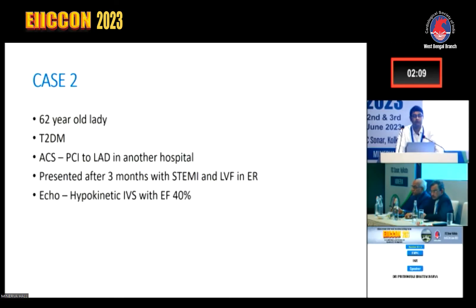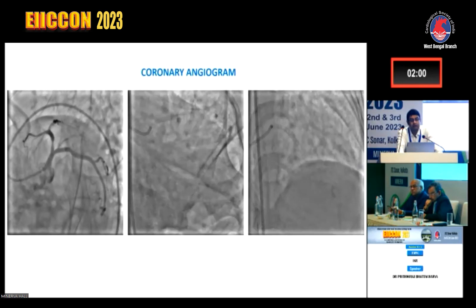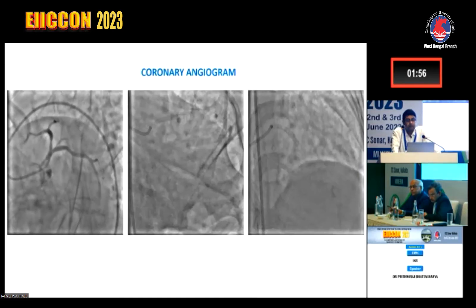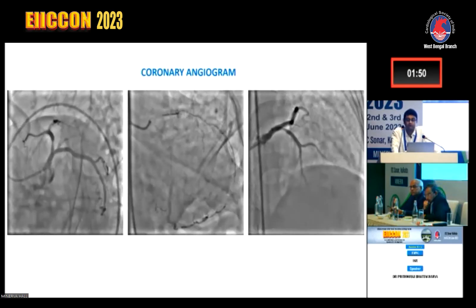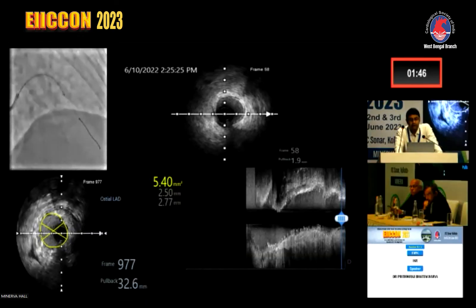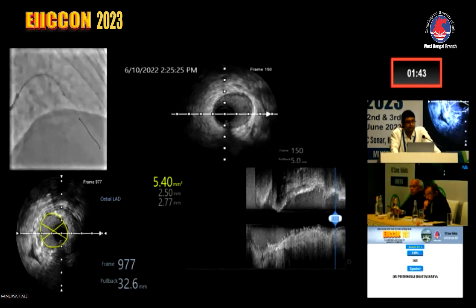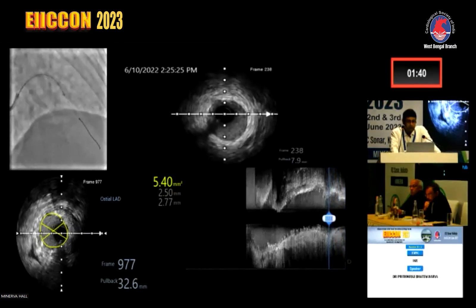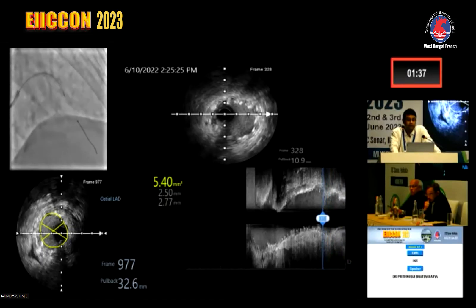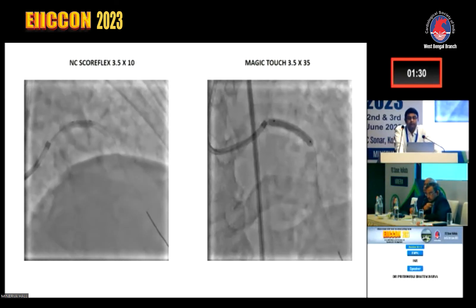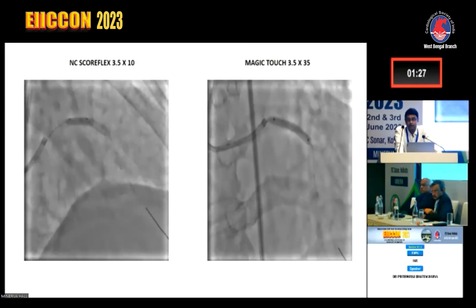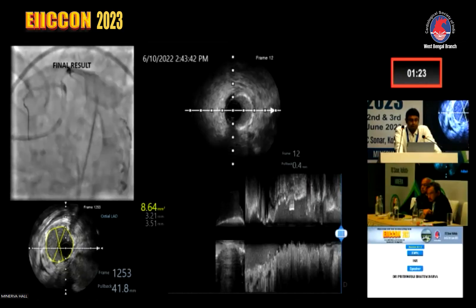Case 2: a 62-year-old diabetic lady who had ACS-PCI at another hospital, presented after three months with STEMI and echocardiographic hypokinesia of the IVS. Angiogram showed a lesion in the proximal part of the LAD stent, likely due to under-expansion or under-sizing. IVUS confirmed a very low minimal luminal area in the proximal stent. We pre-dilated with a Scoreflex balloon 3.5×10 mm and applied a sirolimus-eluting balloon 3.5×35 mm, achieving a good result. The patient is doing well.